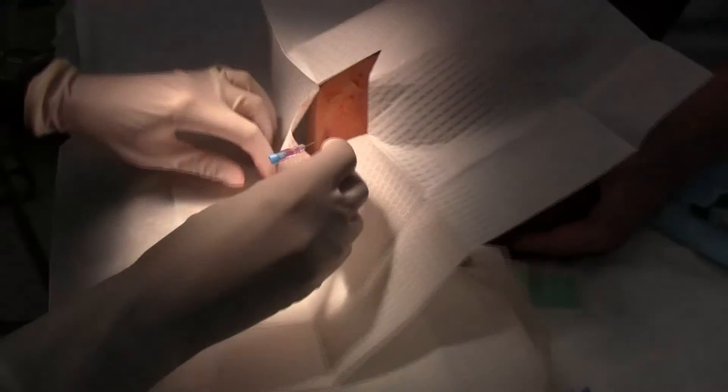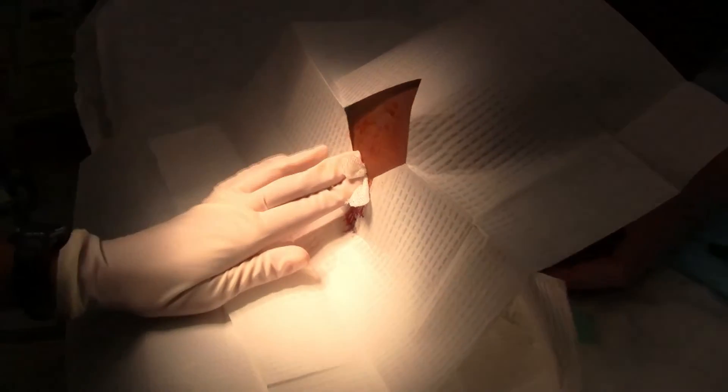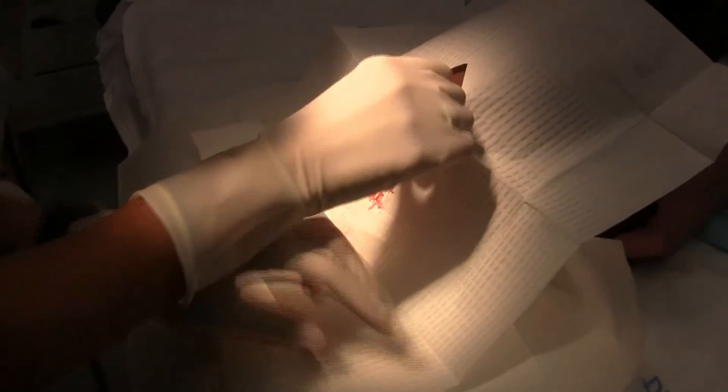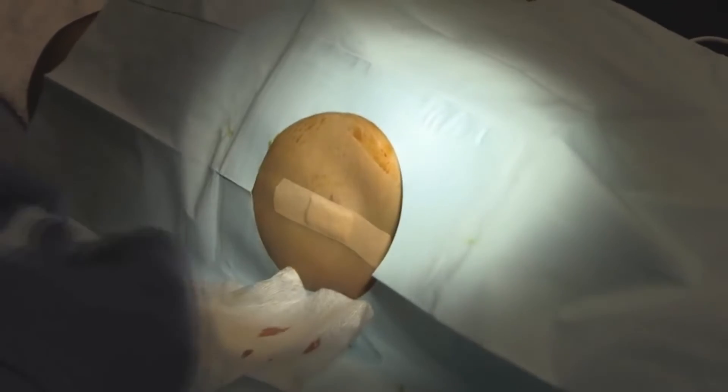After collecting the required CSF sample, replace the stylet and carefully withdraw the needle. Apply gentle pressure with a sterile dressing to the puncture site to control bleeding. The area is then covered with an adhesive bandage to protect it.